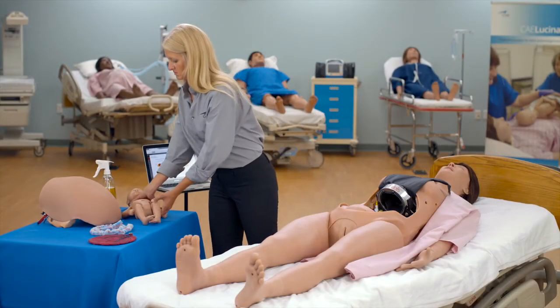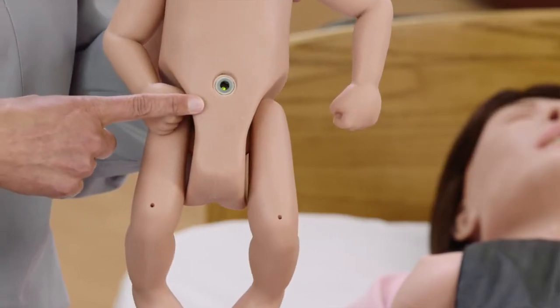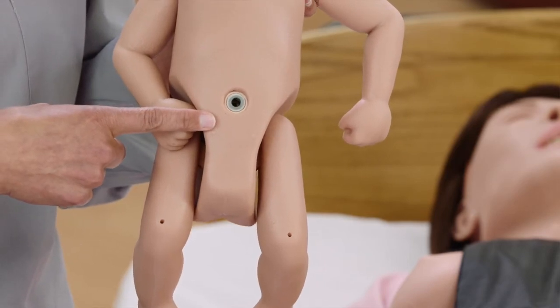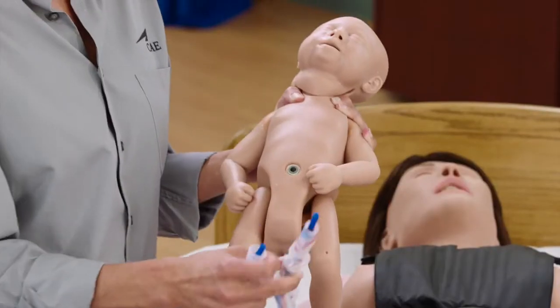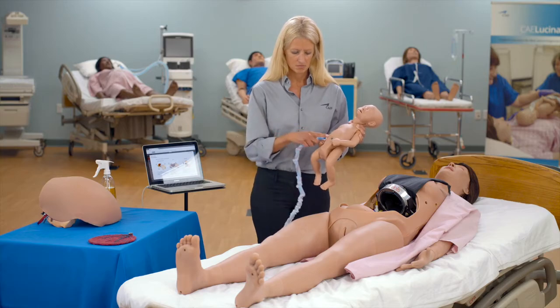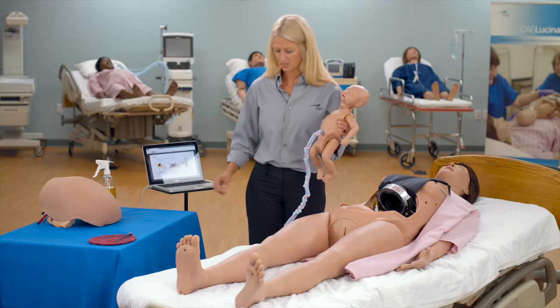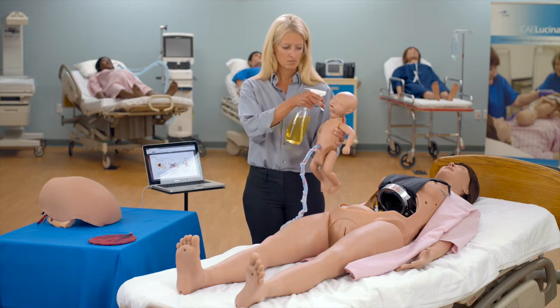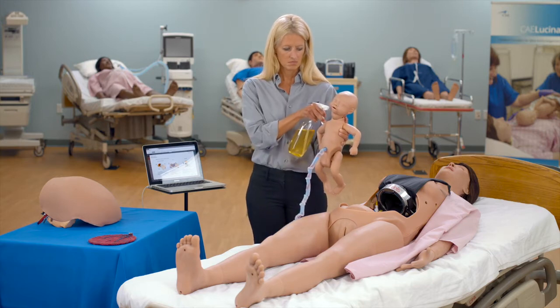To deliver the fetus for a vaginal delivery in a vertex presentation, ensure the fetus is powered on, indicated by the illuminated power light in the umbilical opening on the front of the fetus. Attach the umbilical cord to the fetus by pushing one of the blue ends of the cord into the umbilical opening on the fetus. Lubricate the fetus' head, neck, and upper torso using cottonseed oil. Do not lubricate under the fetus' arms.